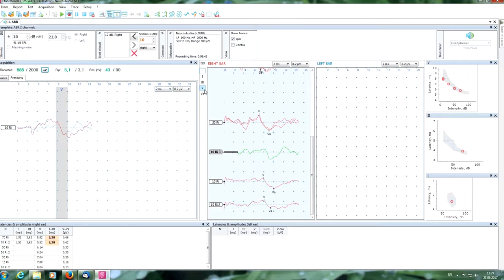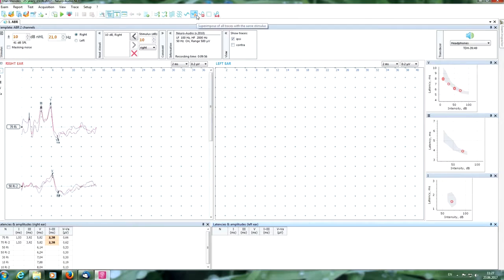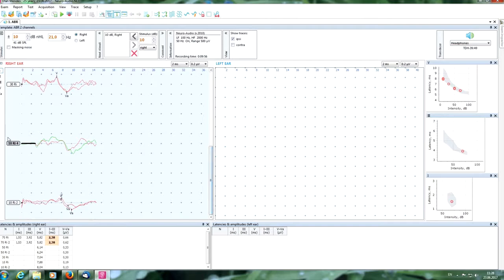You can see the good reproducibility. It is a 5 wave, not noise. We have good statistical parameters of signals, and we can stop. Put the markers, overlay, amplitude enough. So we have a patient with normal hearing. Also, you can repeat all the procedure on the left ear.